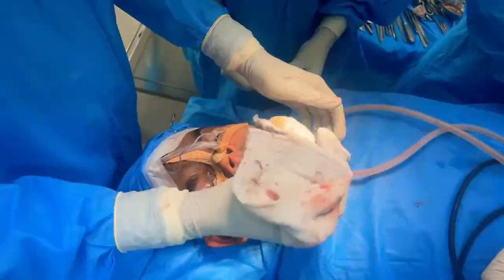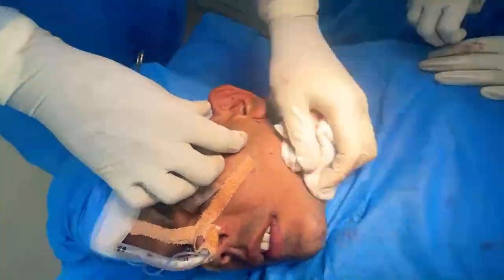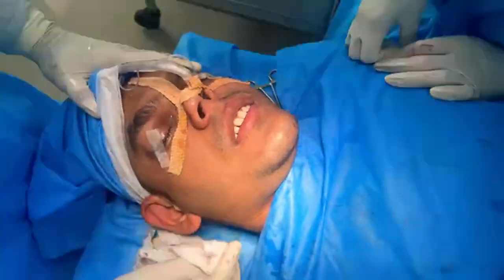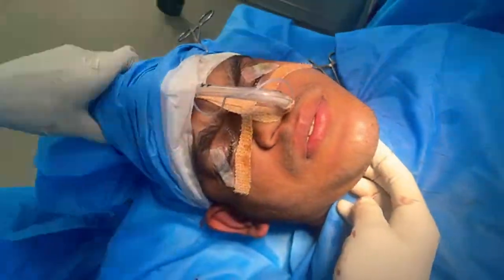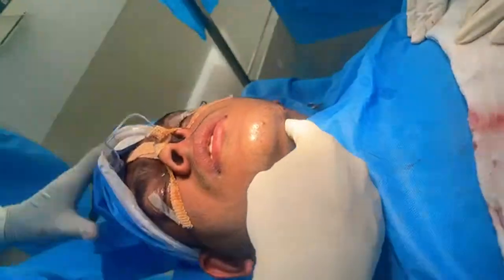It's got a very, very pleasing look straight away. So you can see the marking here. This is the original shape and I've got it in this way now. We've got very little work on this side, but I still have done there. So to get the symmetry, you can see that it's pretty symmetric. You've got the chin in the midline.